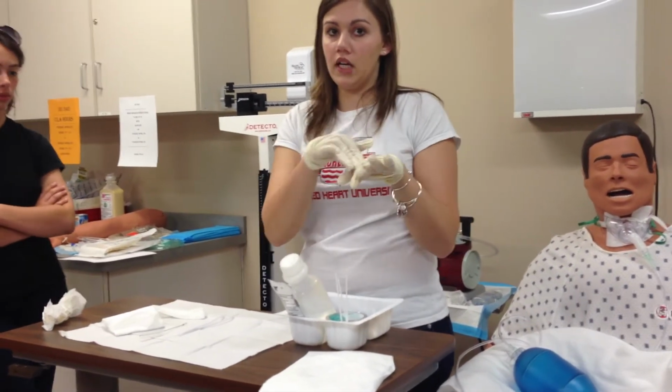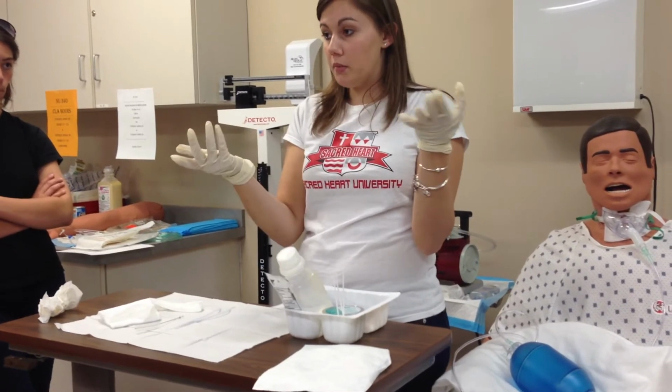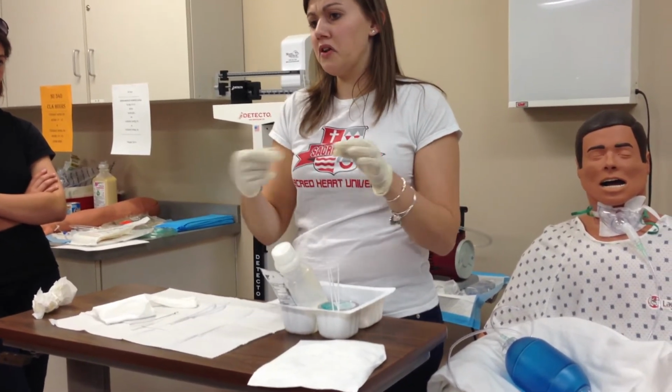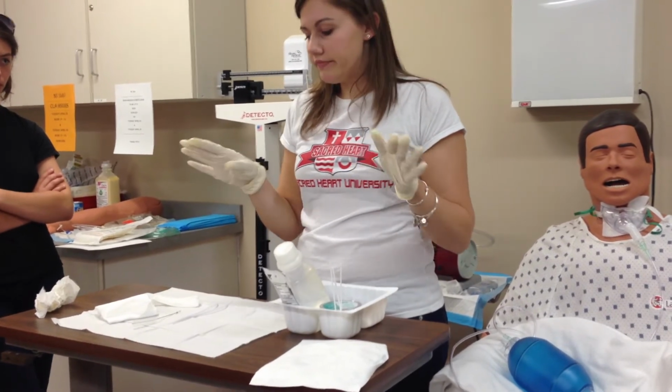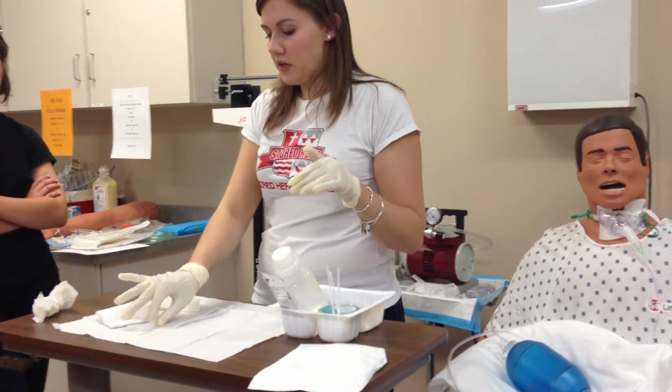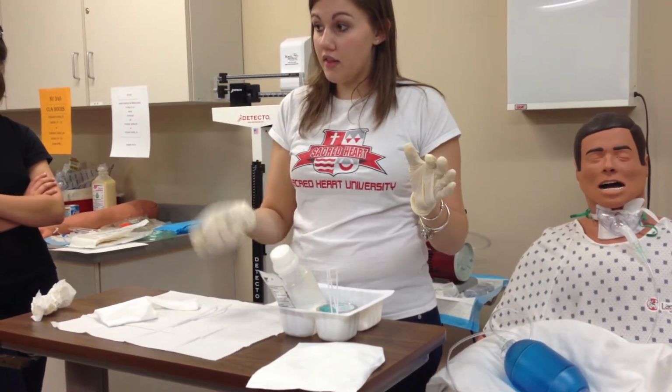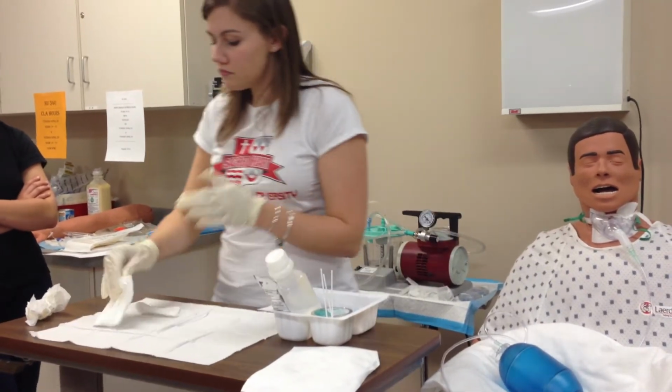So if you think about when you get a cut, you clean it with hydrogen peroxide because it bubbles and gets all of the gunk off. And then the half strength is what you're scrubbing it with technically, but whatever you guys want to do. Then I would put this in the big basin so you remember that's where you're putting the catheter.